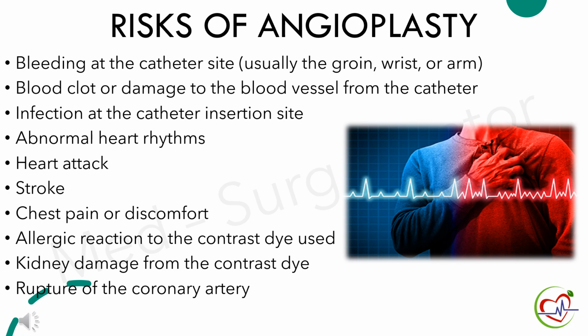There are some risks for the procedure angioplasty, and they are bleeding at the catheter site, blood clot or damage at the blood vessel from the catheter, infection at the catheter insertion site, abnormal heart rhythm, heart attack, stroke, chest pain or discomfort, allergic reaction to the contrast dye used, kidney damage from the contrast dye, and rupture of the coronary artery.